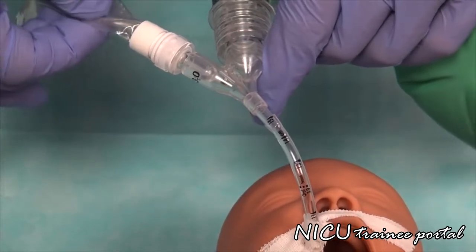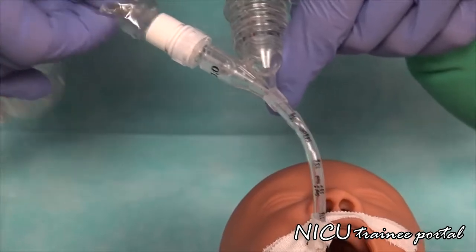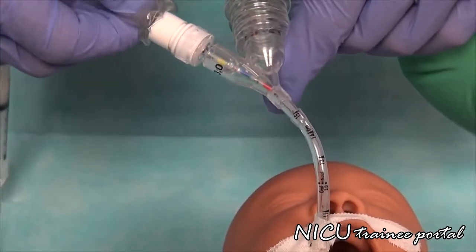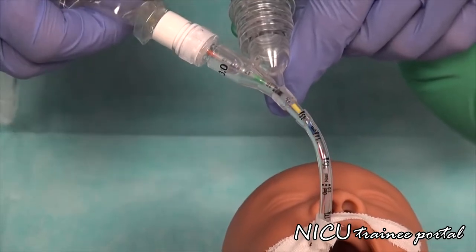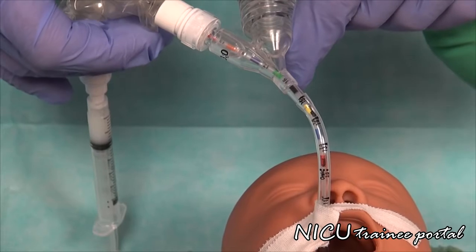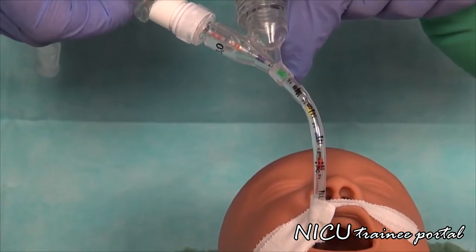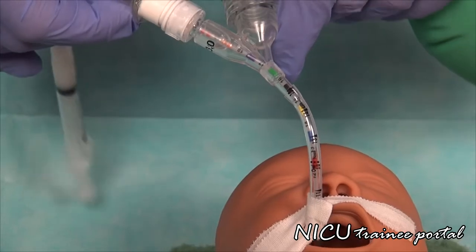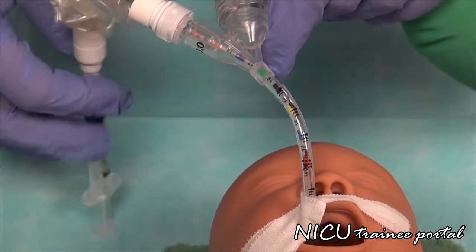And that looks like this. I will be inserting this down the endotracheal tube until my markings match up. So I have the 14 at the 14, and then you can advance about a half centimeter beyond that, ensuring that you are just that distance beyond the endotracheal tube prior to administering the surfactant.